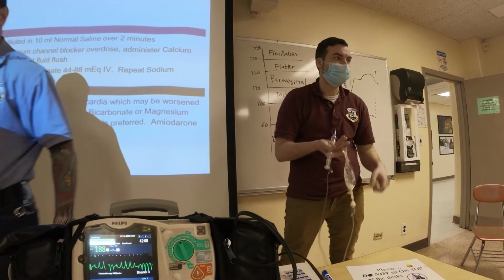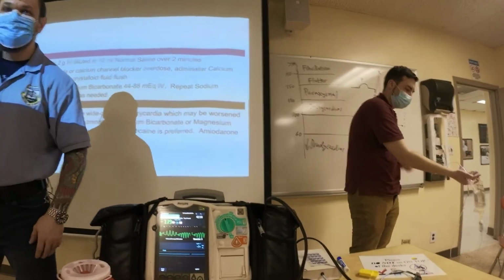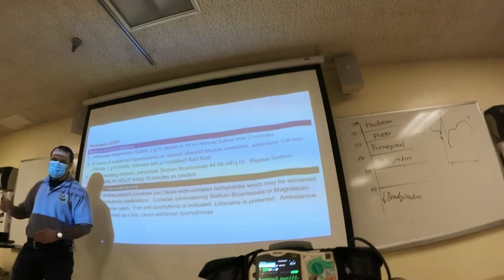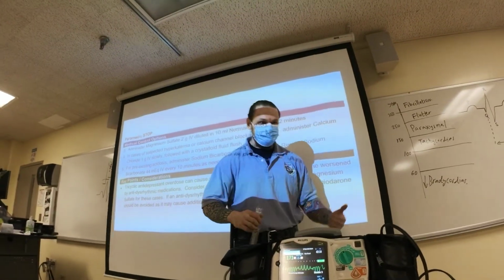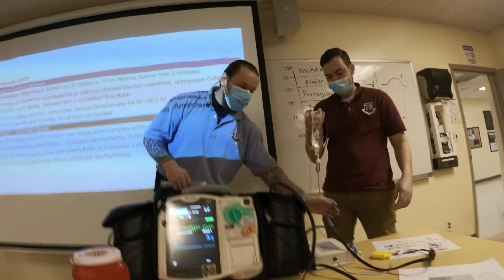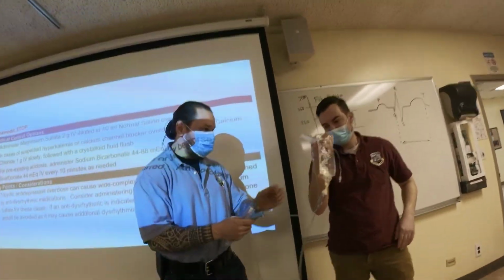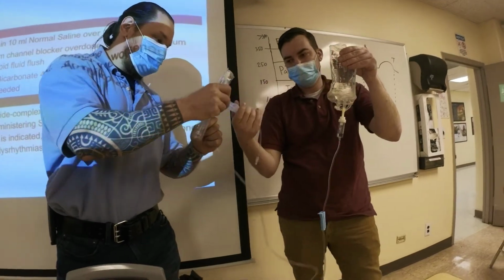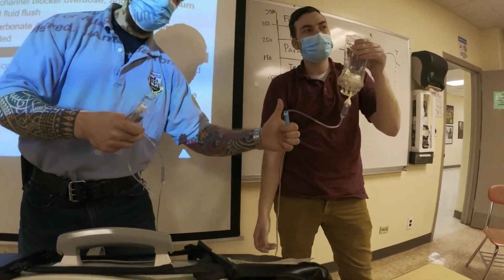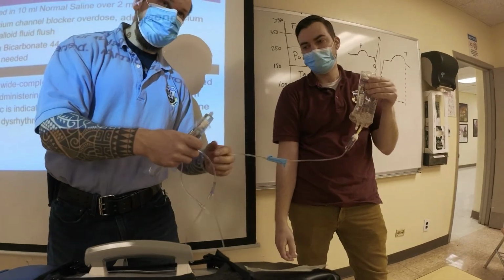Question? Yeah. Do you follow it with the flush? Yeah, absolutely. So any medications you give here, the reason why I did not first connect the flush, I can do... Georgie, come back. So here, every medicine you give, you follow up with the flush, so good question. But here what I can do is this. Imagine I gave the drug. I do this, disconnect, and then I do this, right?